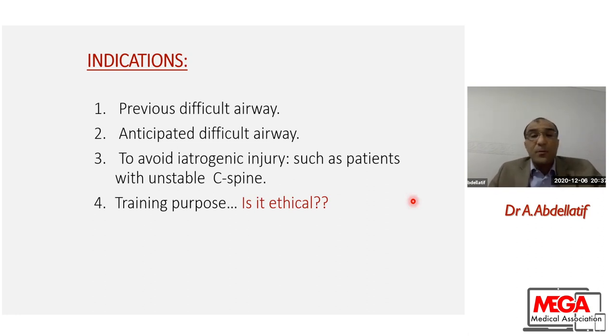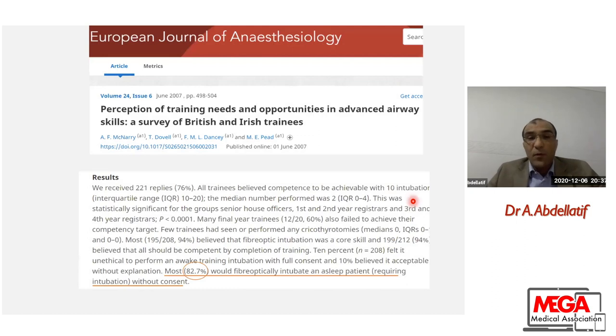Is it ethical to use the fiber optic when the patient is under general anesthesia, to use the fiber optic to intubate? Yes, 100%. For me, it's 100% ethical, as long as I am doing a good preparation, I am choosing a skillful assistant with me, and I am asking for a supervision from an expert around.